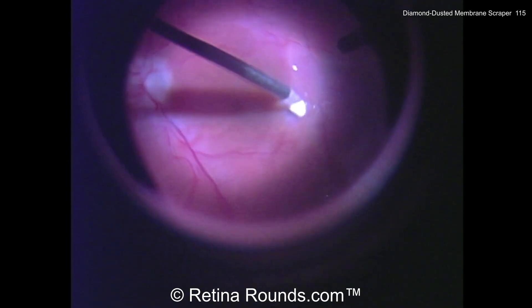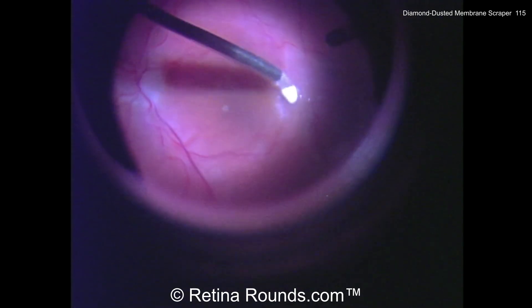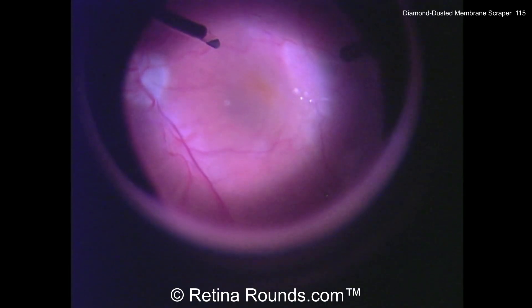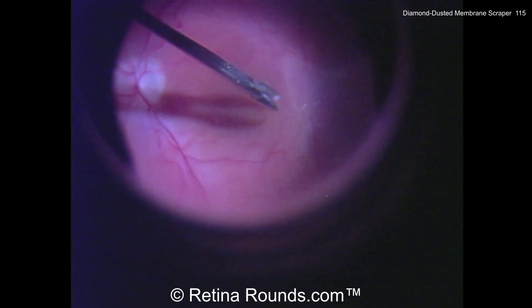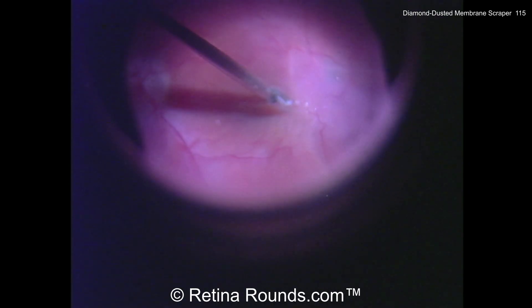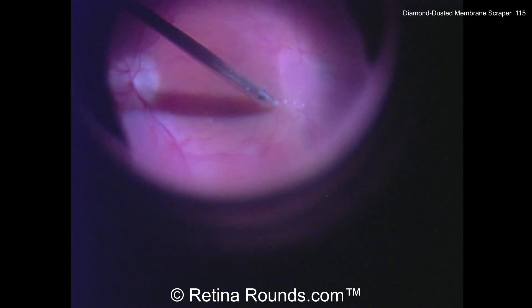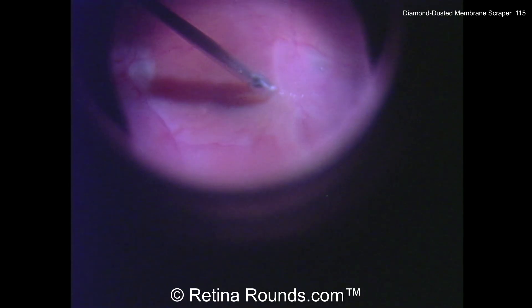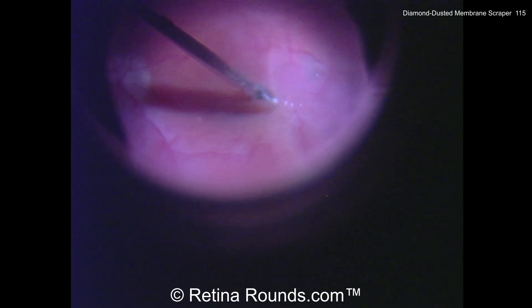Depending on the surgeon's preference, you can use the very tip of it, which will be a little bit gentler, or you can use a broader platform, rubbing that against the surface of the retina to elevate an edge of ERM. You do have to be careful, though — the membrane scraper is a quite robust instrument, and it can actually damage the inner retina if not used judiciously.